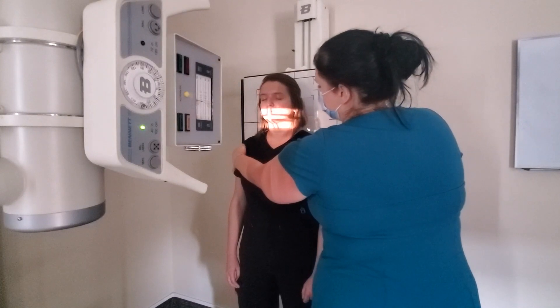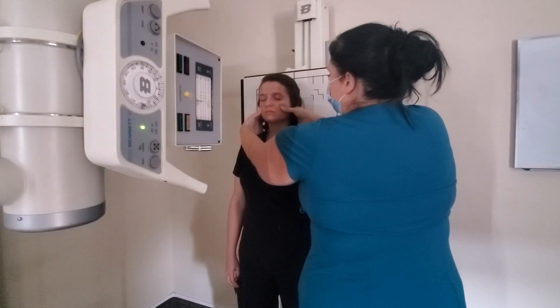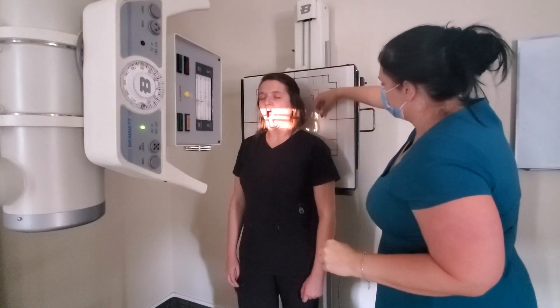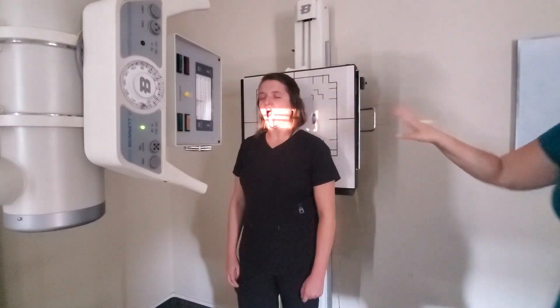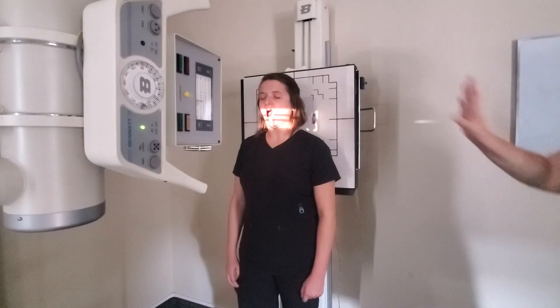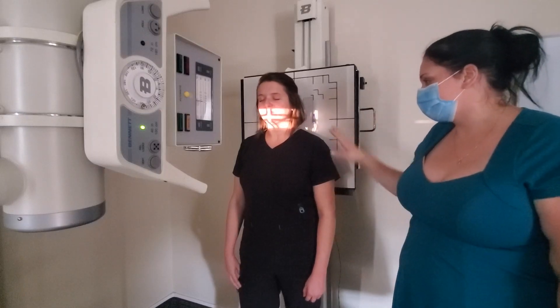I'm going to shift, right on the MSP, holding that face in place, and then have you open your mouth as wide as you can. Centering goes straight through that open mouth, with my marker within the light field on a 10 by 12 crosswise cassette. That's how you do an AP open mouth — both of these at 40 inch SID, crosswise cassettes, centering to that open mouth.